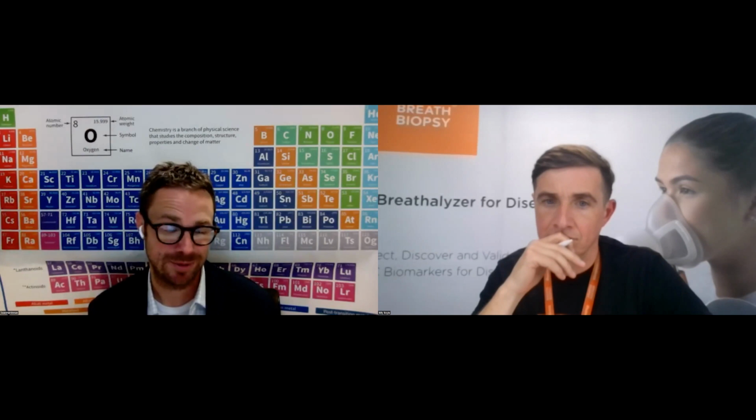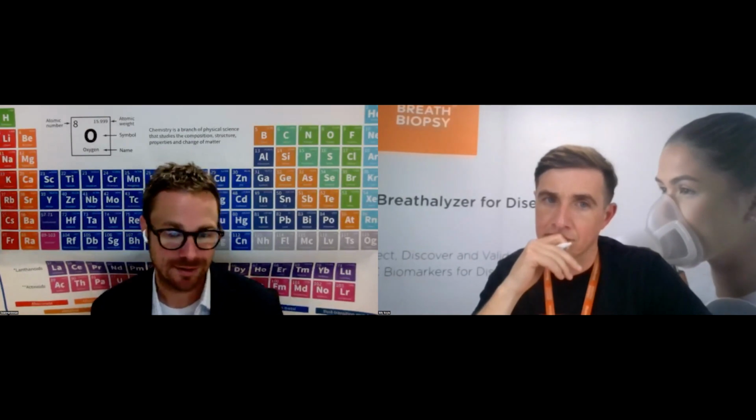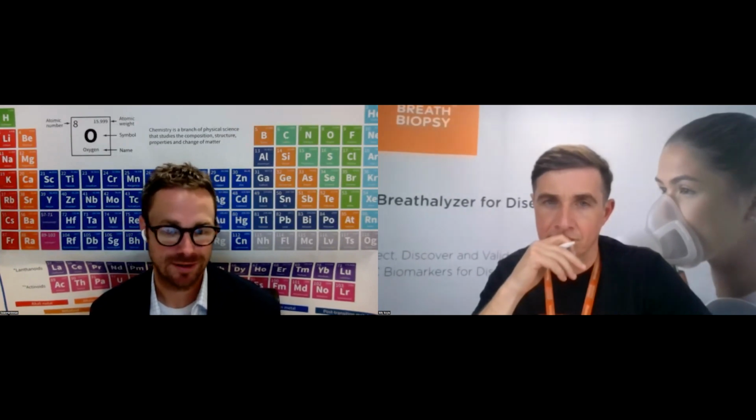And so the idea is we have historically used 1 hour of fasting as our rule of thumb. Obviously, more the better, but that is essentially what we've used. I'm not familiar with any distinct data that suggests maybe it's 15 minutes, maybe it's 4 hours. It probably depends on the food that was eaten. So the idea would be that we would have this library to say, oh, well, you told me you ate an apple half an hour ago. You should be good. I have data that suggests that all of the apple-related volatiles are below the background or something to that nature, is where we're trying to go with the contamination thing.